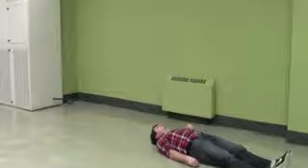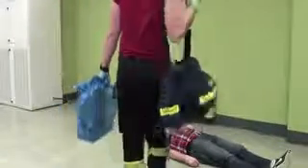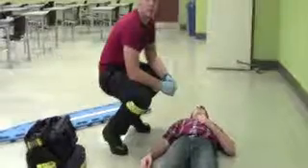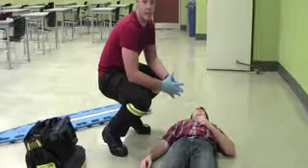Once I've completed this, I am able to move in and make contact with my patient. When coming up to my patient, I want to tell them not to move, introduce myself, and then ask for consent.